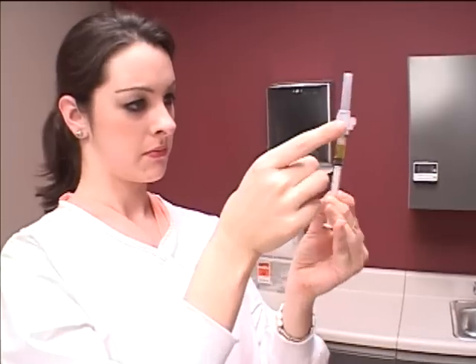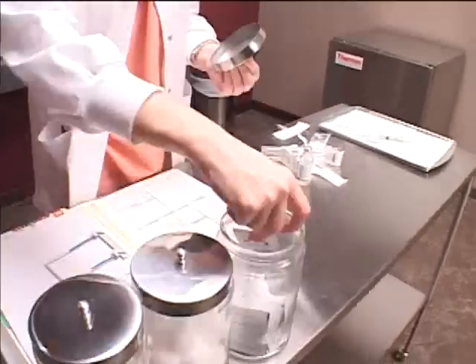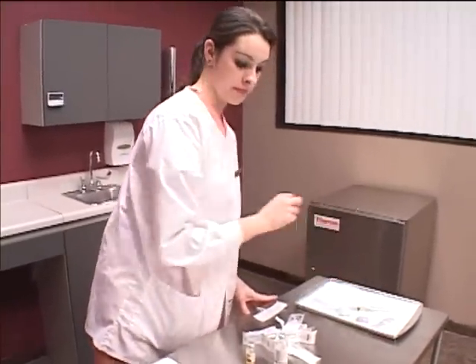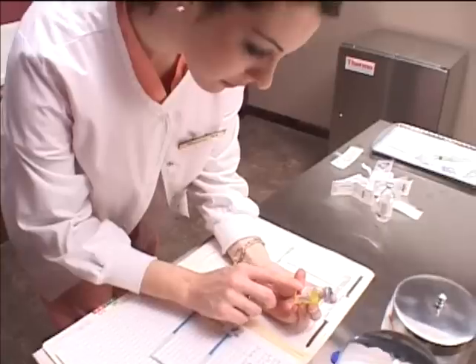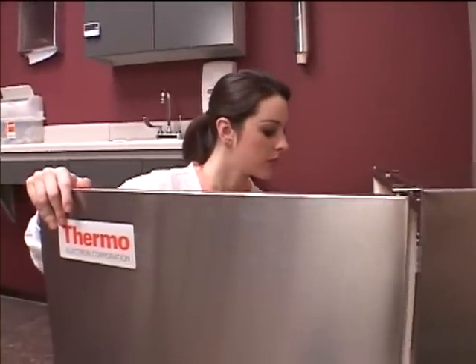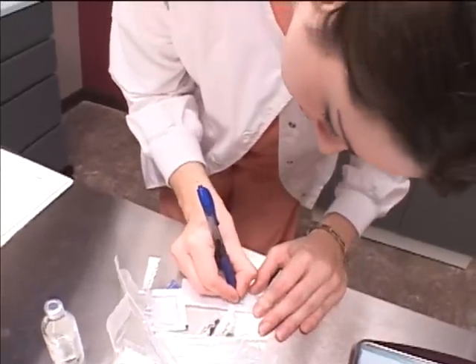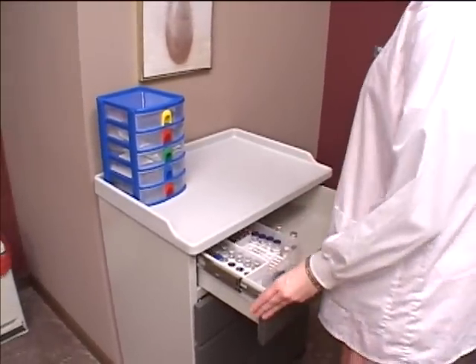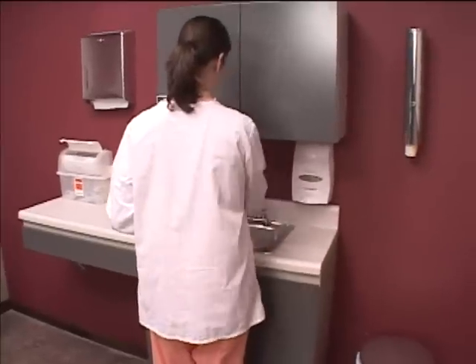Recap the needle and flick the syringe to remove any air bubbles and place the syringe, cotton balls, alcohol pad, and adhesive bandage onto a medication tray. Check the medication against the physician's order before returning it to the appropriate storage area. Label the wrapper if necessary with the appropriate information. Return the diluent to its proper storage area. Dispose of the trash. Finish by washing your hands.